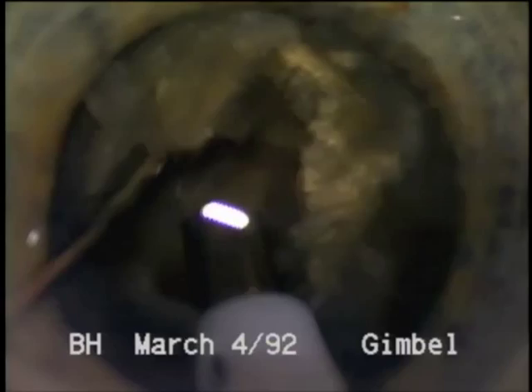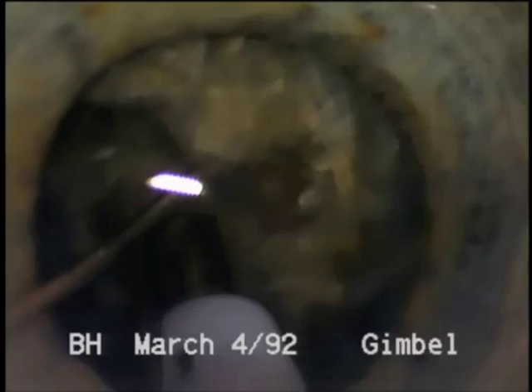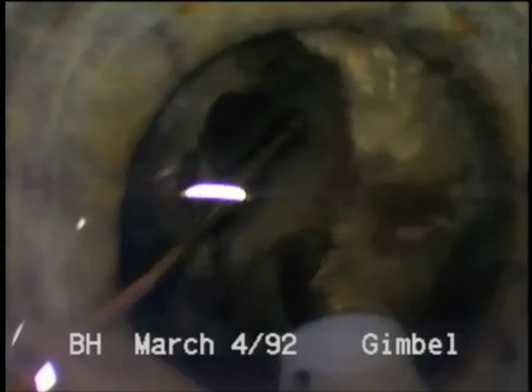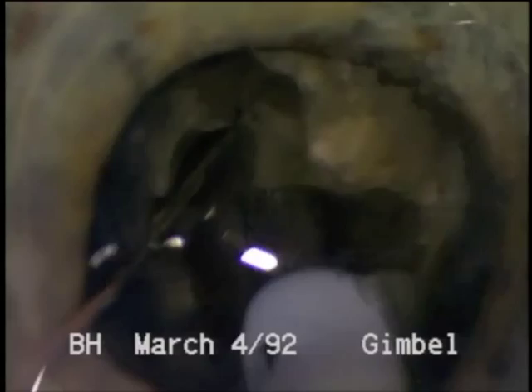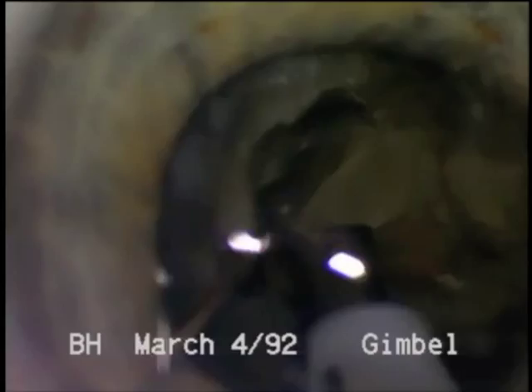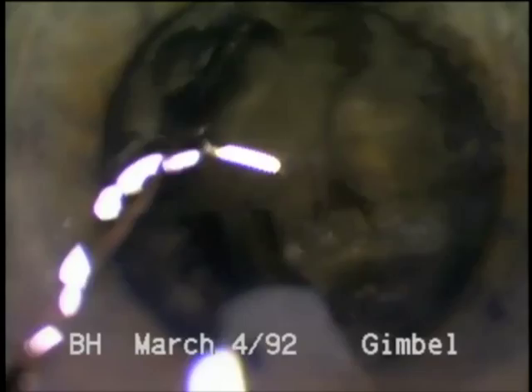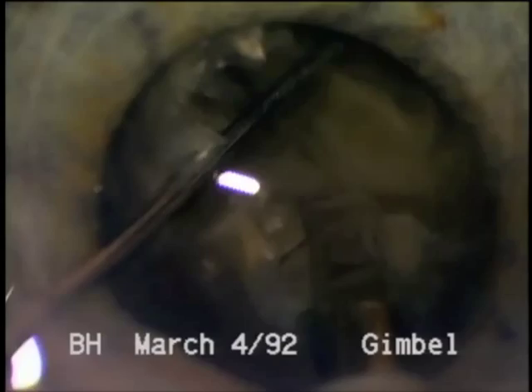Note the rotation of the lens, which is facilitated by adequate hydrodissection to remove the central part of the nucleus. Note that the sculpting is done in the upper part of the lens, ending the sculpting stroke just past the center of the nucleus. The second instrument is used to nudge the nucleus inferiorly to accomplish this down-slope sculpting, because sculpting in the upper part of the lens allows the travel of the phaco tip to be parallel to the slope of the posterior capsule — a concave slope, like sculpting down the slope of the posterior capsule.